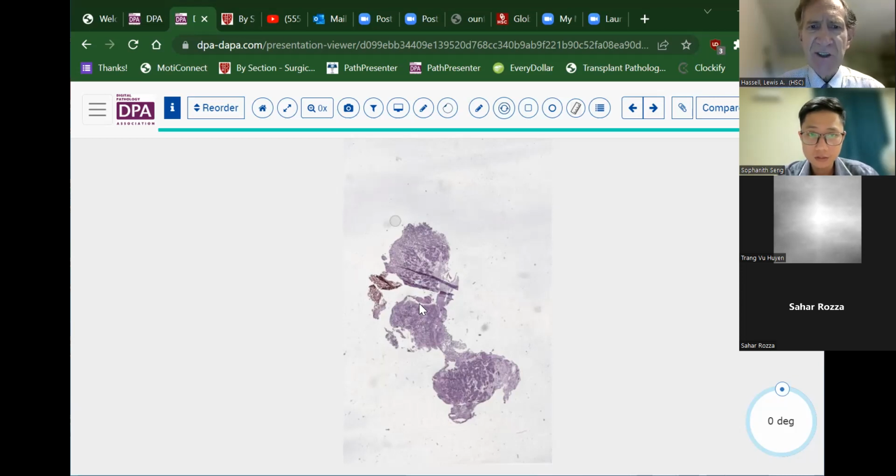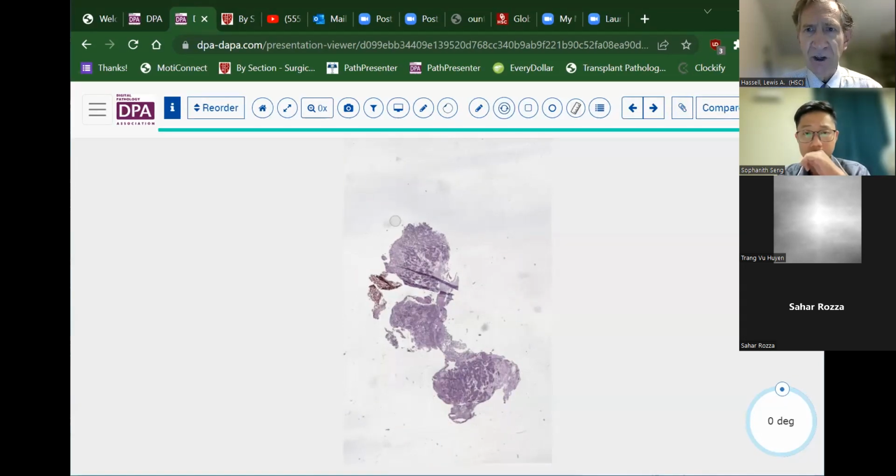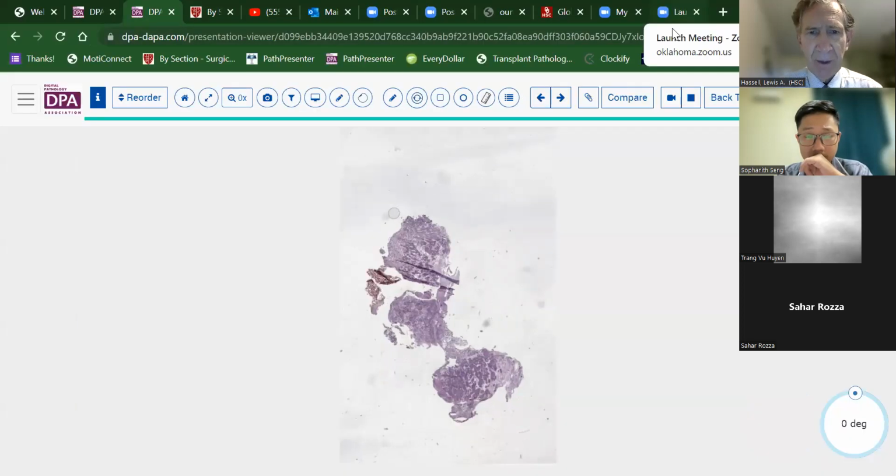So sometimes that's the question we're being asked, is to triage the sample to know whether to send it for cytogenetics or to send it for flow cytometry or something of that sort. And so this nasal mass, I think, prompted that kind of consideration. Is this a lymphoma, plasmacytoma, or something like that that could benefit from further evaluation by additional ancillary testing?